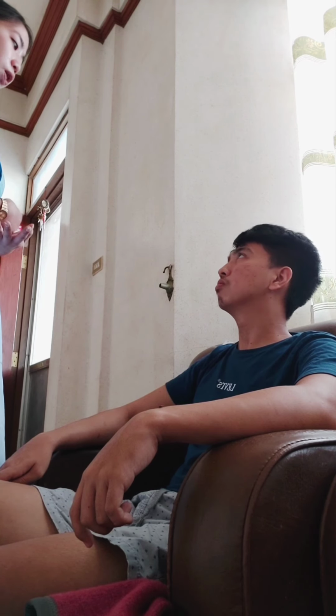Okay, then now explain the procedure and purpose of the procedure to the patient. Good morning po. So now I will do the Rinne and Weber's test. These are the exams for hearing loss. They help determine whether you may have a conductive or sensorineural hearing loss. This determination allows a doctor to come up with a treatment plan for hearing changes.